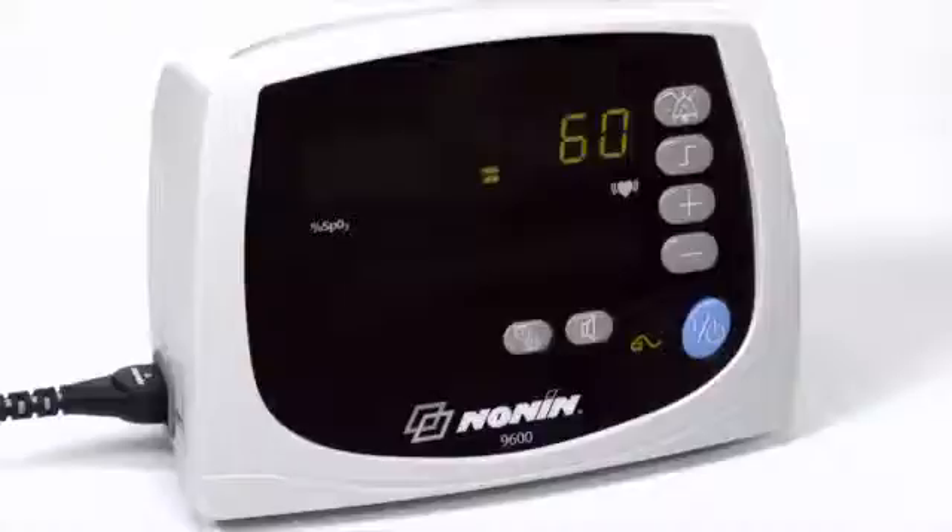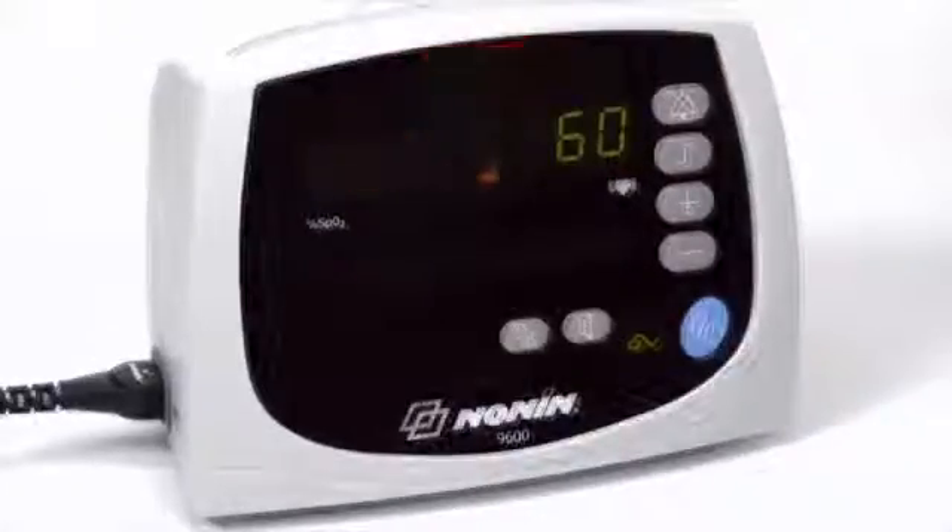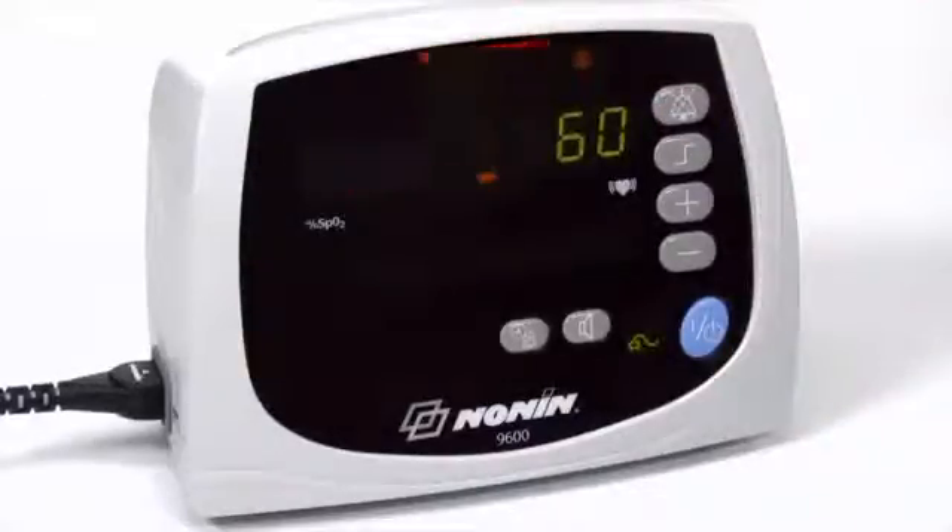If oxygen saturation or pulse rate readings go outside of the limits, the oximeter will sound a 3-beep, 2-beep audible signal that repeats every 10 seconds. Red LEDs on the oximeter will flash in unison. You can silence the audible alarm for 2 minutes by pressing the bell icon button, and you can return the audible alarm by pressing the button again.